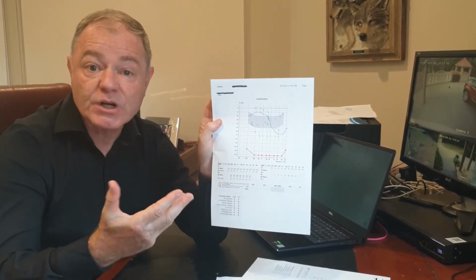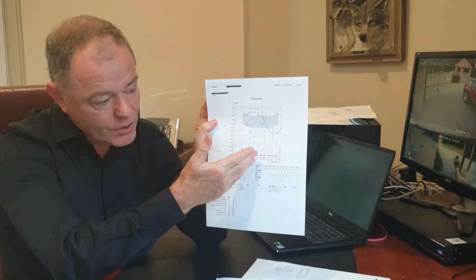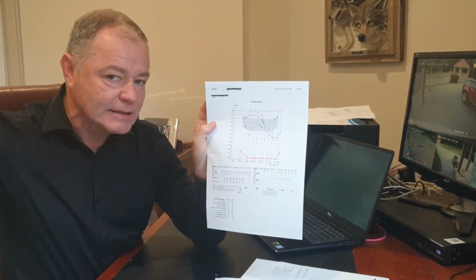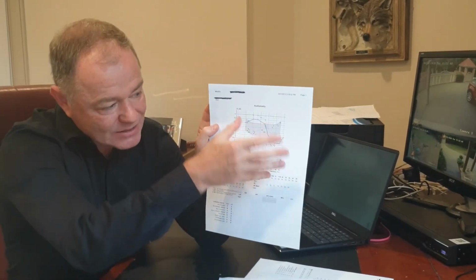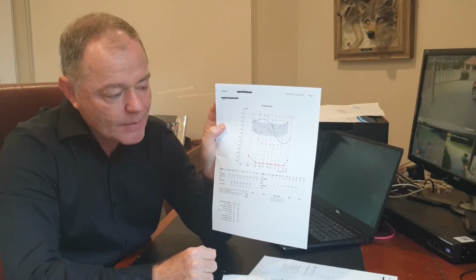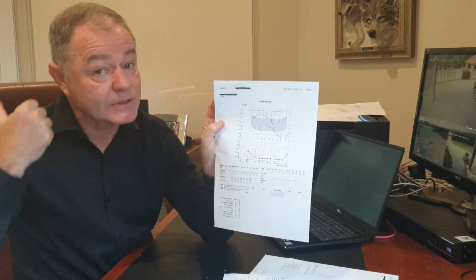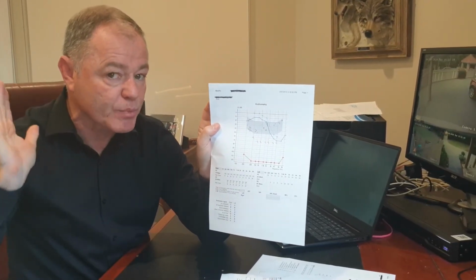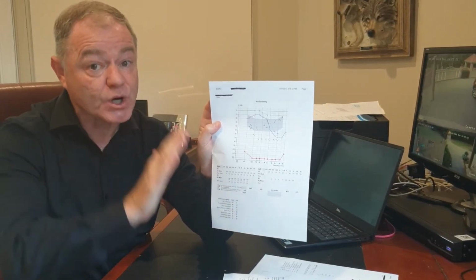Certainly if you're in a situation where you're sitting in a car, if you were the passenger trying to hear the driver, then you'd be really struggling, even though the left ear is a mild to moderate loss. If you were to wear the bicross, you would have no trouble being able to hear the driver. So in situations where the person you're wanting to listen to is isolated on that bad or dead side, this works well.